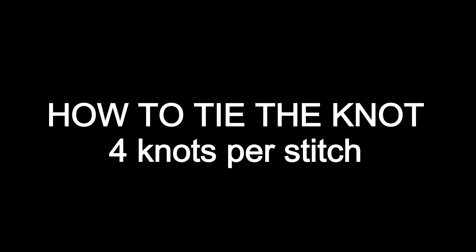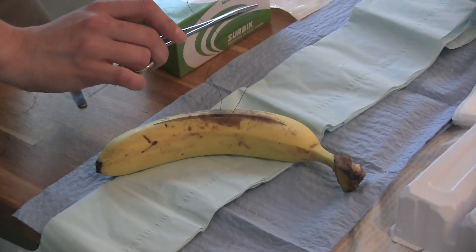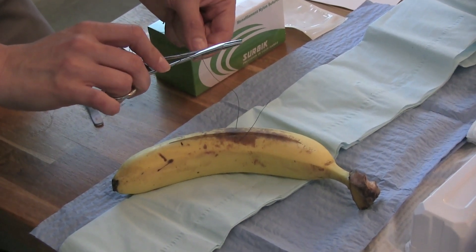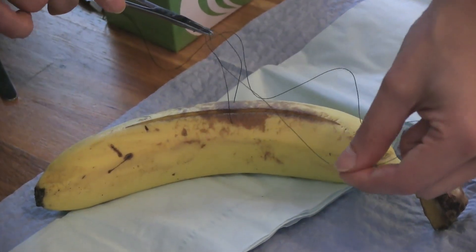Next, it's time to tie off. Figure at least four knots to be safe. Leave an inch or two of tail. Take your needle driver or tweezers and wrap your thread around it twice. Open the needle driver a little bit, grab the tail and pull it through, and lay the stitch down.